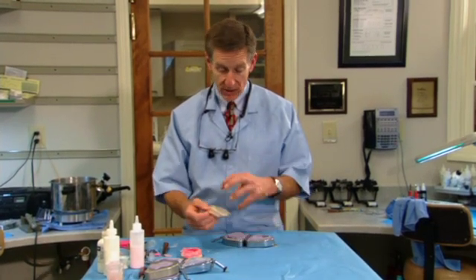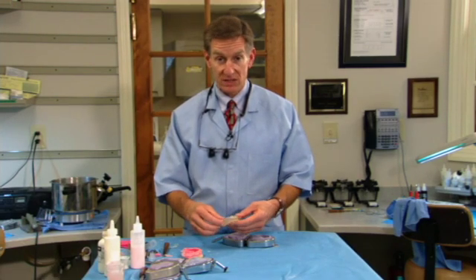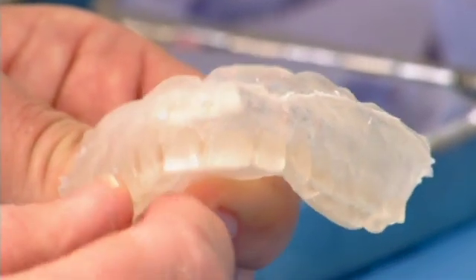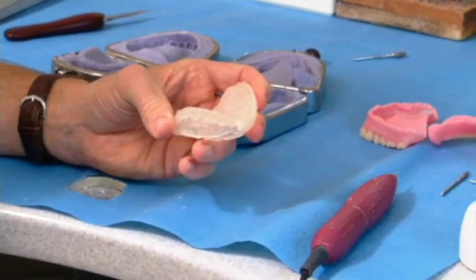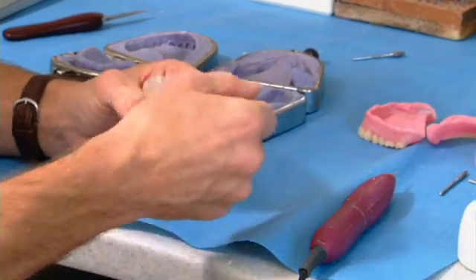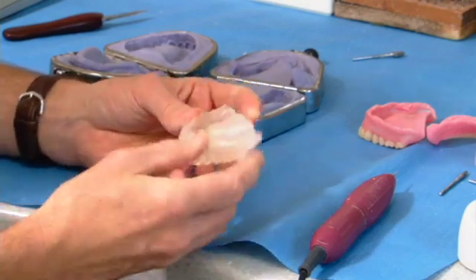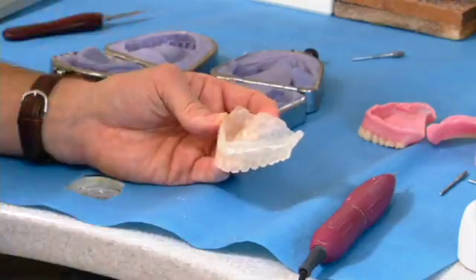There again, we can also put different contrast medium mixed into the acrylic to serve as a scan guide, just as we discussed. What this does is it preserves the tooth position, the flanges, and the intaglio and the external surface of the approved provisional denture for the lab. You can see the excess is just a little flash around the edge, and we got a little bubble right there in the palate. If we're going to do a wash reline, we can fill that in with impression material. If not, we can put a little clear acrylic in it, put it back in the jig, and just fill it in the jig.